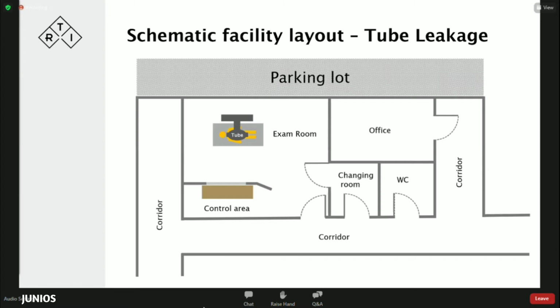So the leakage arises because, as you know, for X-ray production, here in the tube, we have X-rays emitting in all directions from the target or the anode, and not just in the direction of the primary beam. So although this tube housing is shielded, heavily shielded, I might say, some leakage radiation can still be transmitted.